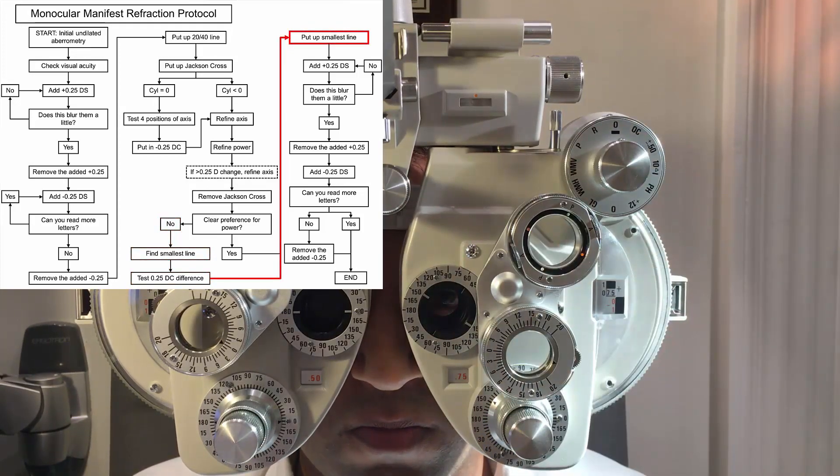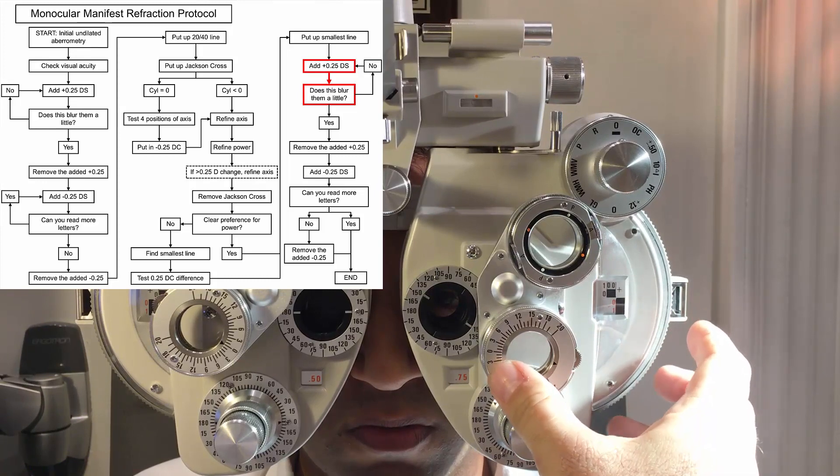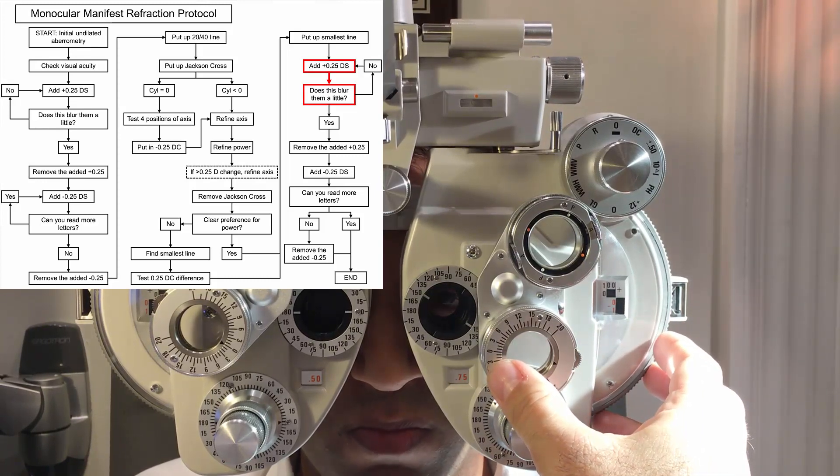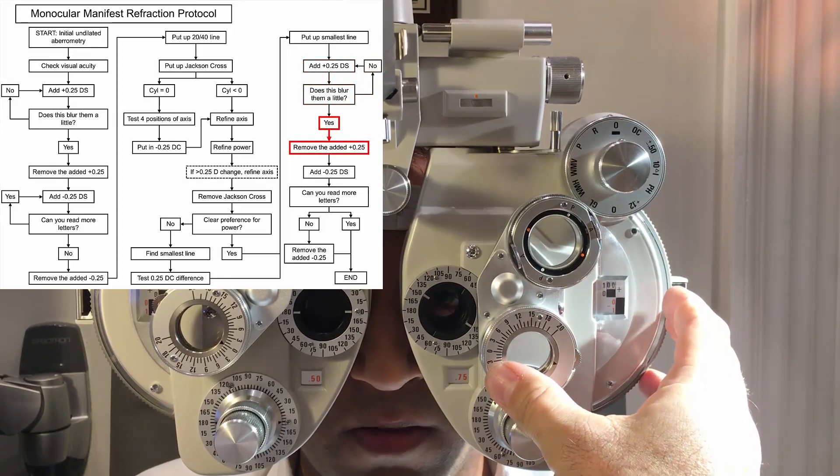And now, how far down can you see there? Something, something, O. Does it blur them a little bit if I go to there or not really? Yeah, it's a bit more. A little bit. More if I go to here. So better here. Yes.